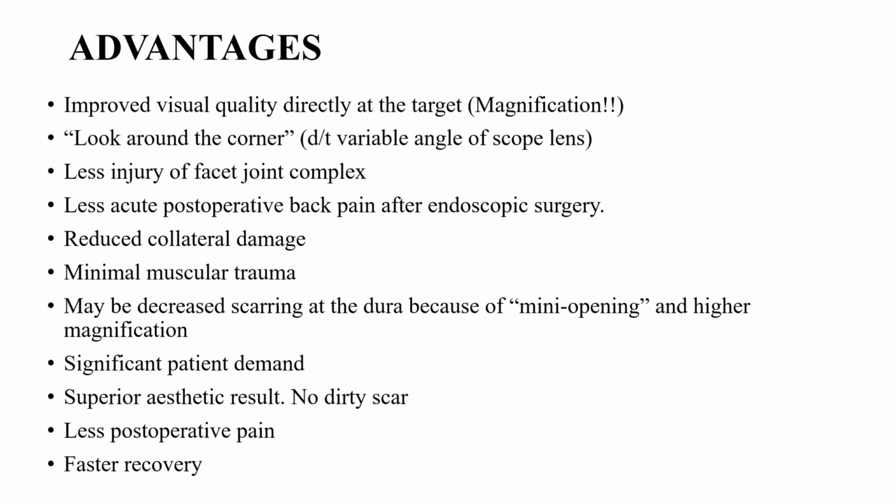You are doing a very calculated facetectomy, whatever is required, only that part you are doing, and as your scope can go inside, you are doing a limited facetectomy. Post surgery pain is almost nil as there is minimal incision and you are not cutting any muscle, you are just dilating the muscle. There is reduced collateral damage, minimal muscular trauma, and moreover there is no dirty scar later on, less post operative pain, and recovery is really very fast.